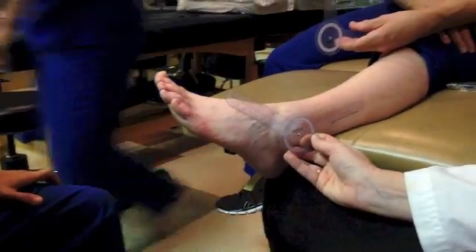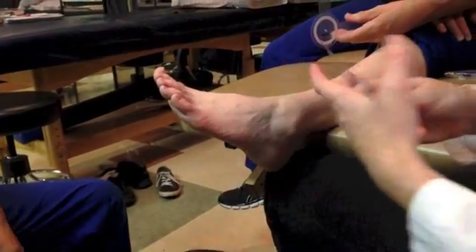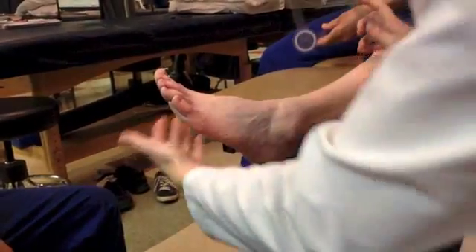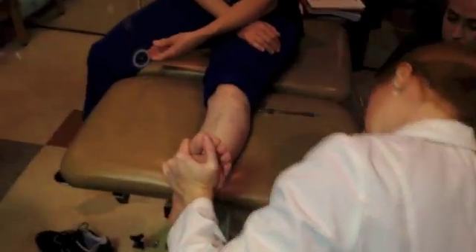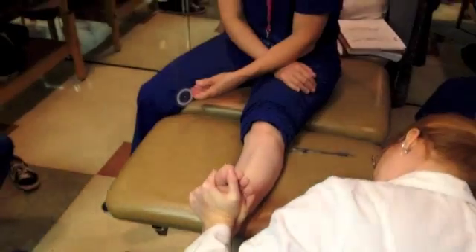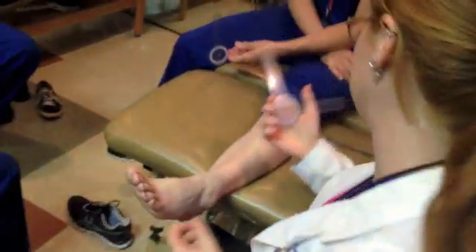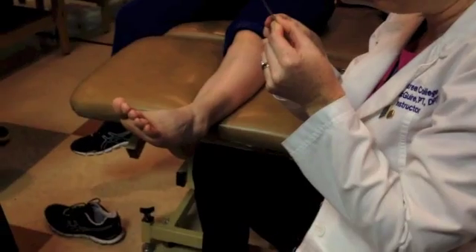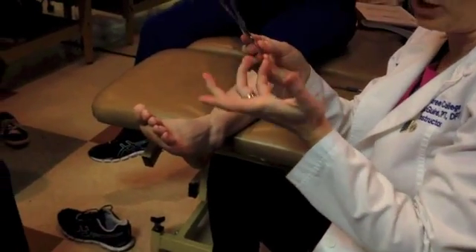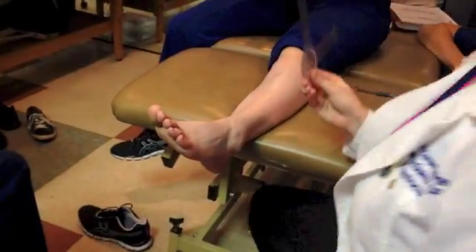I want to measure dorsiflexion. Remember, we always do passive and use our eye goni to start. I'm going to take her passively — it may take a little bit of force — and put her up in dorsiflexion. I'm guessing she has about five degrees, maybe ten. So I'm going to preset my goni to about five — that's 95 if you're looking at the black numbers, but five degrees on the outside red numbers.